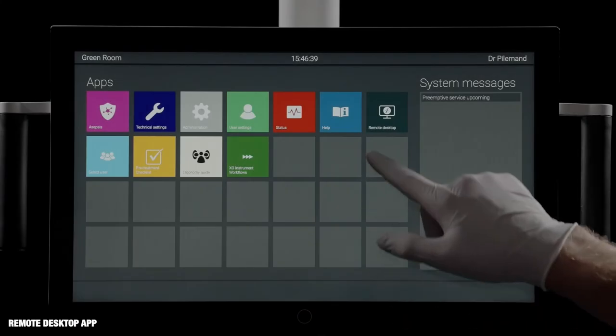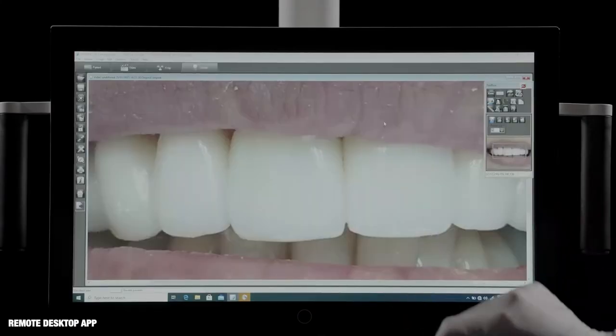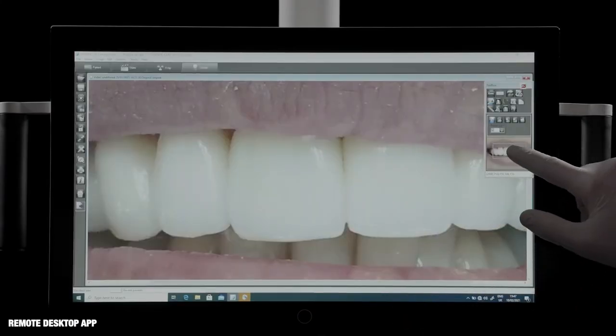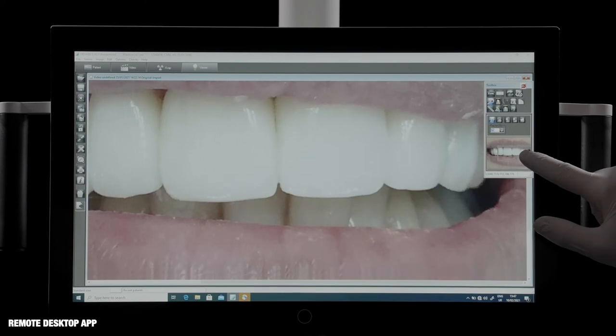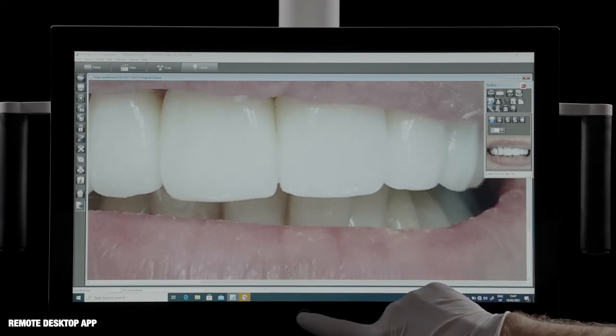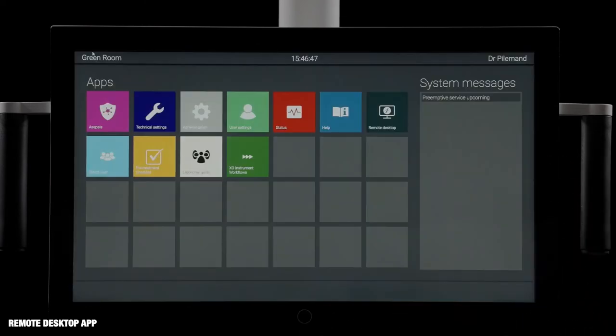The Remote Desktop app, for example, makes it possible to view and manage software solutions and images, etc., stored on a remote computer.